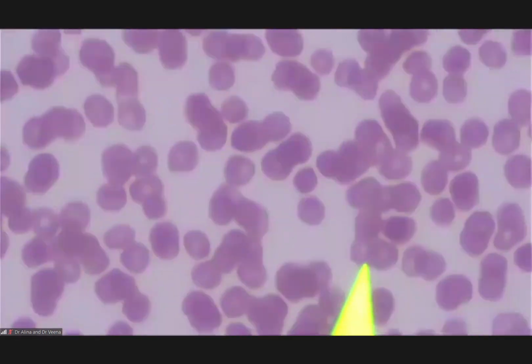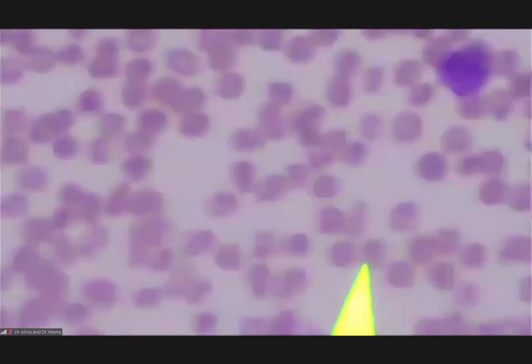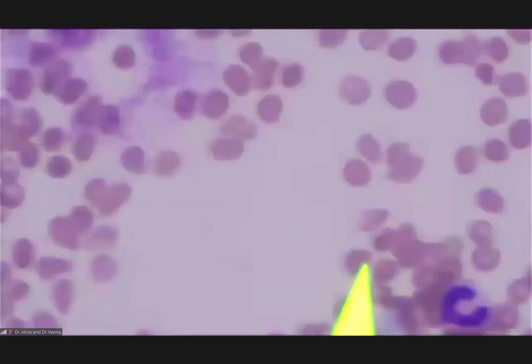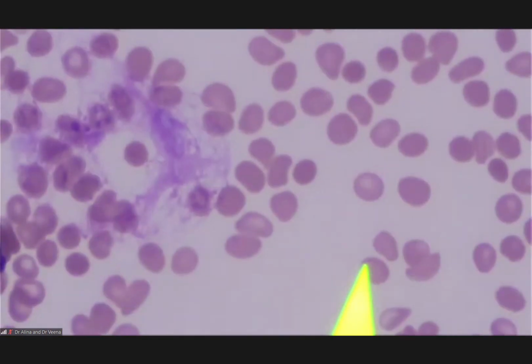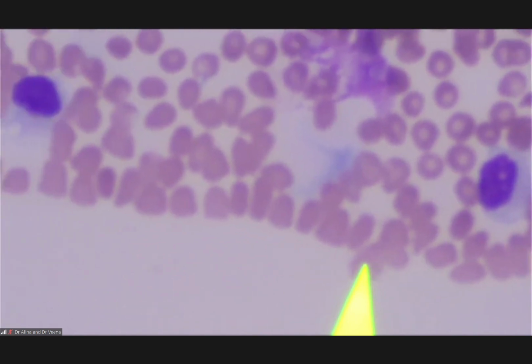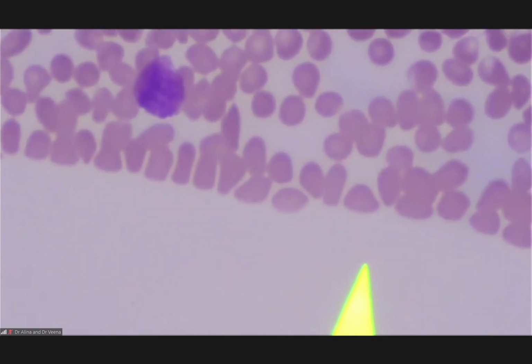And for Burkitt lymphoma, it doesn't mean that all the cells will have this typical vacuolation. You don't expect to see all of them having this vacuolation and whatnot. Okay, because the entire picture actually does look like an acute leukemia. Just that if you look hard enough, you will find these special cells with the vacuole, and putting the history together to get a diagnosis of the kids.